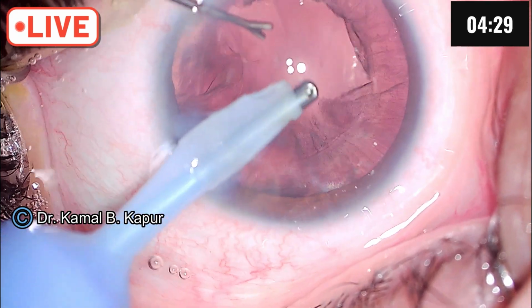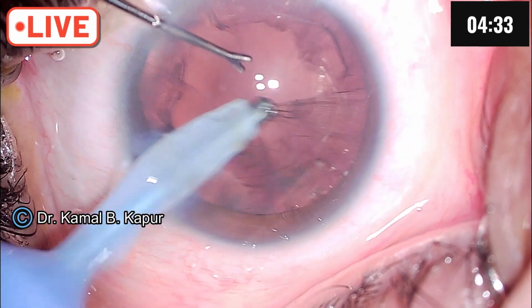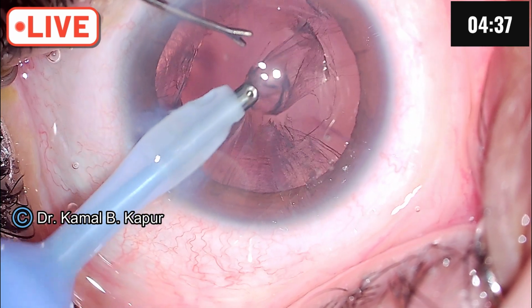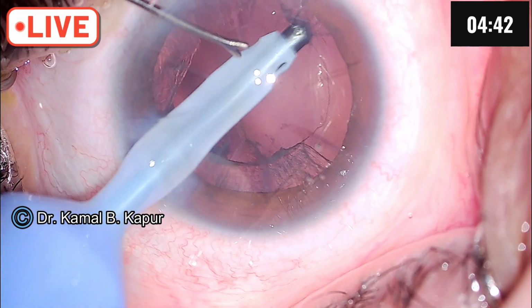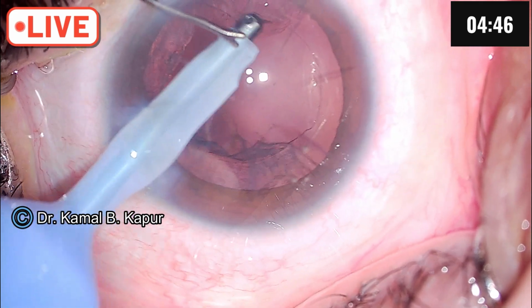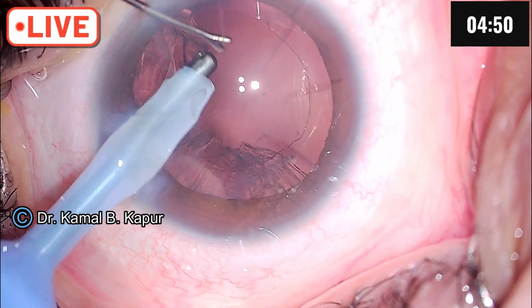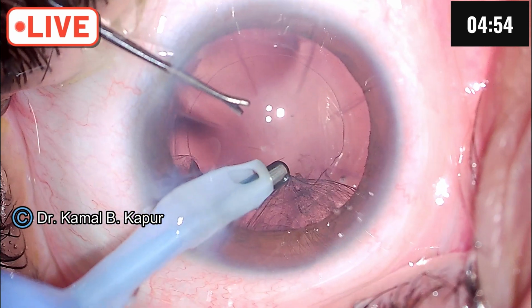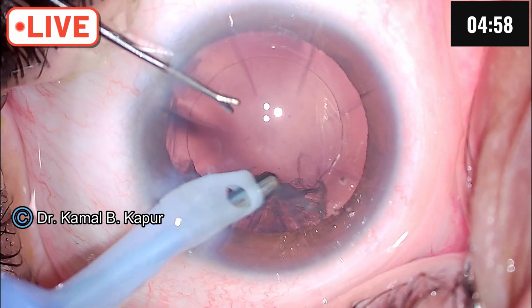Again, dipping the side port, making sure the chamber is not over-pressurized. There is also some slight leak of fluid from the main wound, which is also to my advantage. Increased intraocular pressure is the sole culprit when these corneal incisions will open up, and you will notice how beautifully we've been able to maintain the corneal incisions, no distortions.